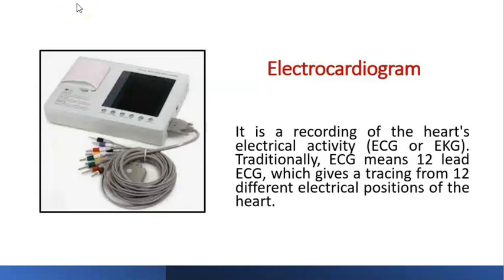The electrocardiogram. Electro means electricity, cardio means heart, and this represents a graph. So then what is an electrocardiogram? It's the graphical representation of the electrical activity of your heart. In other words, it's a recording of the heart's electrical activity, usually abbreviated ECG or EKG.